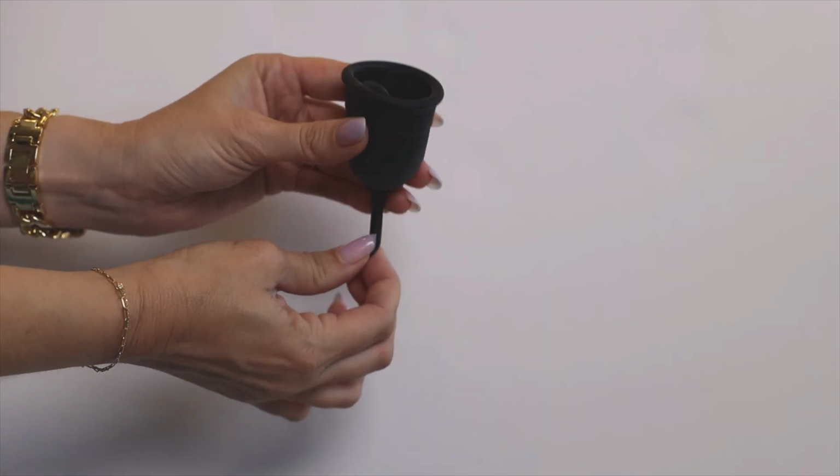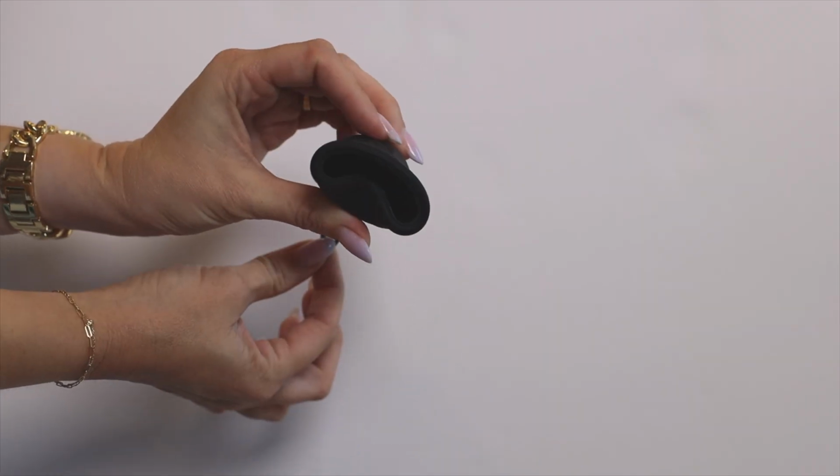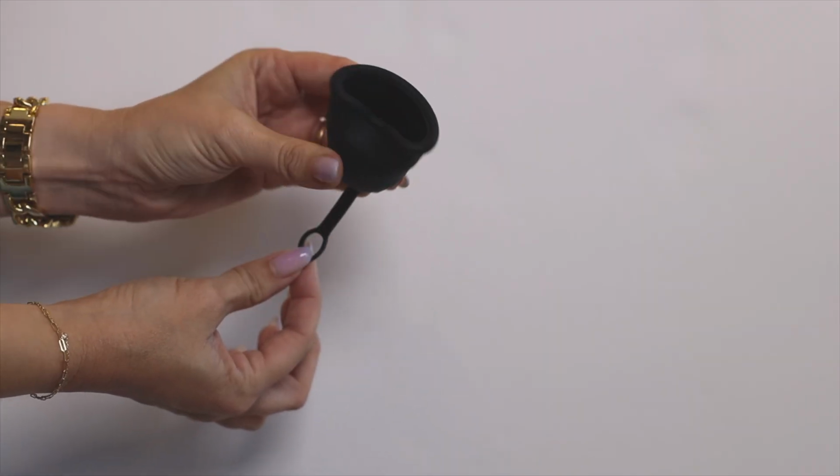It's also a concern if you have an IUD, so you might want to look at menstrual discs in that case because they're suction-free. It also is a little harder if you have access and reach issues or any hand strength issues to break the seal, which is one reason to look at the Flex cup in that case. But the Flex cup obviously also has to fit your anatomy and work for you. But yes, you always want to break the seal. It has a suction. That's a bit of a con depending on who you ask.